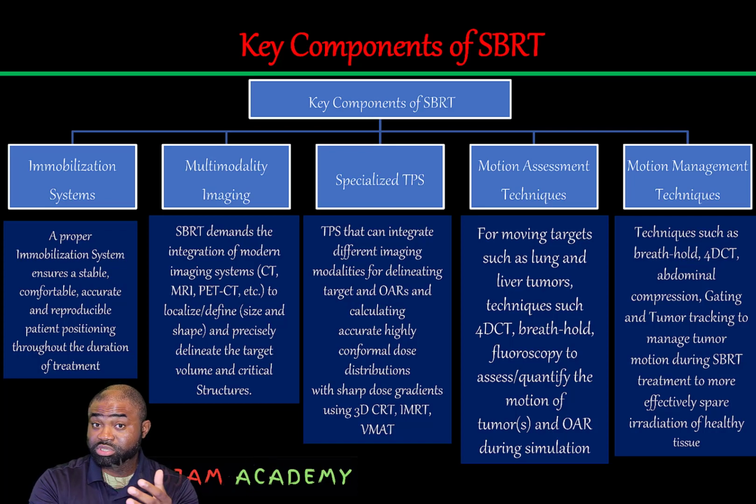Now, a robust immobilization system essentially ensures an accurate and reproducible patient positioning throughout the entire treatment process, from CT simulation to treatment delivery. In other words, it ensures that we know where the target is and we are hitting the target every single fraction. Now, the next on the list is a multimodality imaging system.